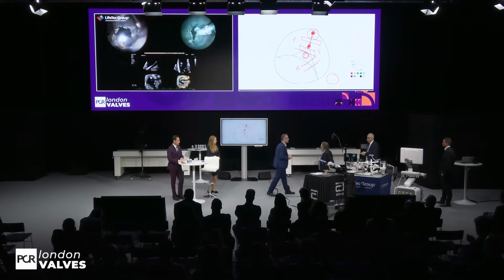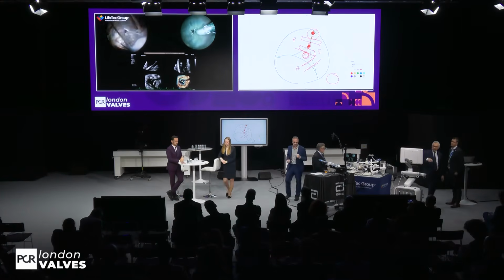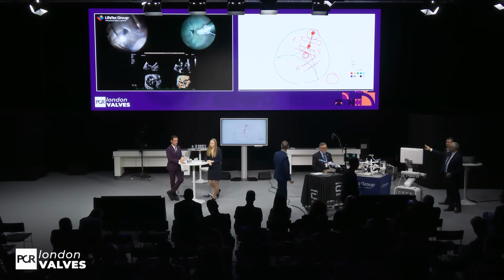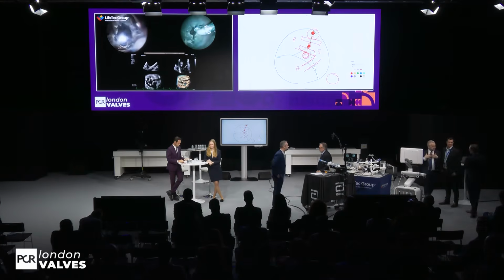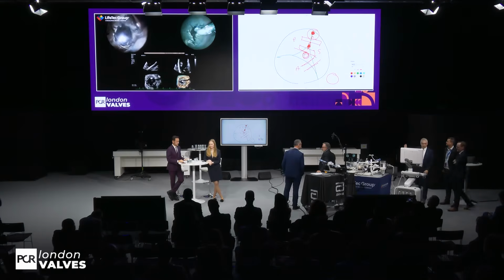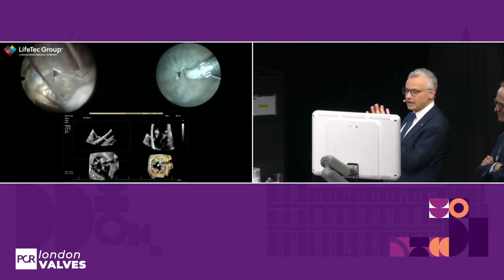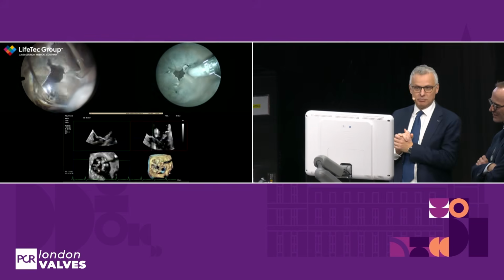So what do you want me to do here? First of all, I want to show the audience the MPR. Maybe everyone knows how to activate this. But if you look at the MPR that I managed to organize, we can see the lead very well. We have been aligning the MPR arrows to the lead itself, which shows very nicely how the lead in this particular animal model is behaving.